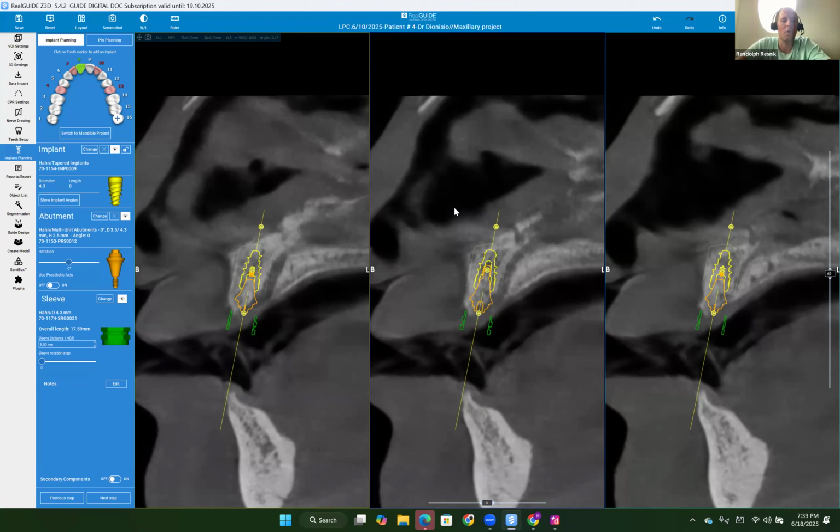So to go through a case like this, where you're putting all this time in and the patient's putting all the money in, what you don't want to do is end up with the implants in the wrong spot. So starting with the digital smile design is great. Then you're able to convert that to a chairside smile design. Have them print it in Essex or a transitional smile where you're able to try it in and verify that you have the vertical correct, the occlusion, and incisal edge position, and then plan it based on that. So yes, you can use that, but I would still verify it chairside prior to putting the implants in, digitally and in the mouth.